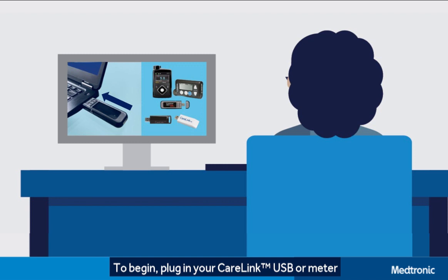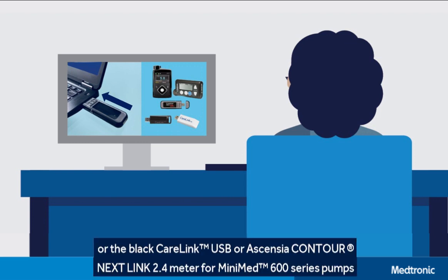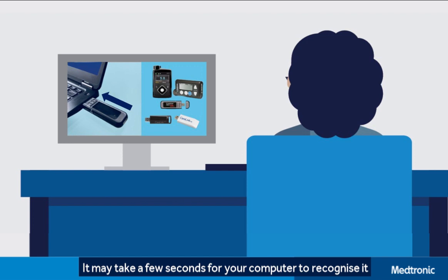To begin, plug in your CareLink USB or meter. Use the white CareLink USB or Essentia Contour NextLink meter for Paradigm pumps, or the black CareLink USB or Essentia Contour NextLink 2.4 meter for MiniMed 600 series pumps. It may take a few seconds for your computer to recognize it.